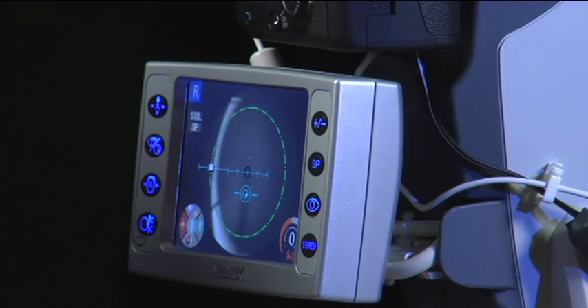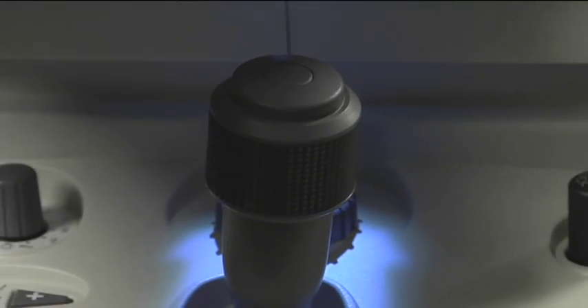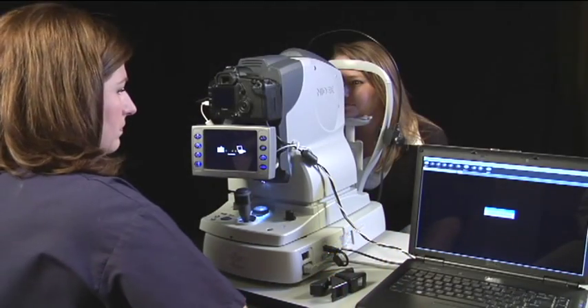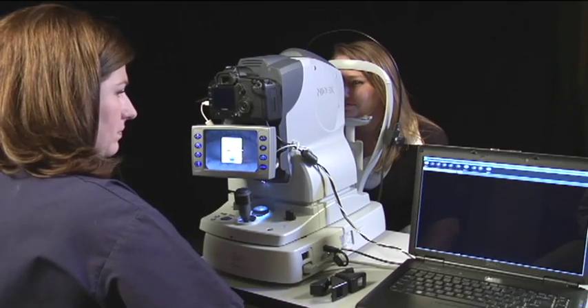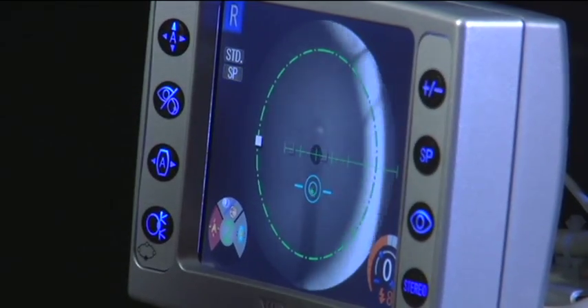After moving the fixation, place the blue ball in the circle and capture the image by pressing the button on the top of the joystick. If you're satisfied with the first image, press the button on top of the joystick to take the second. Now place the green ball in the circle and capture.